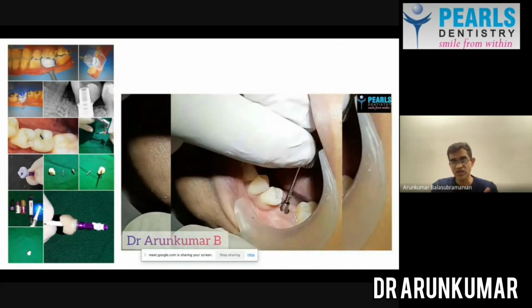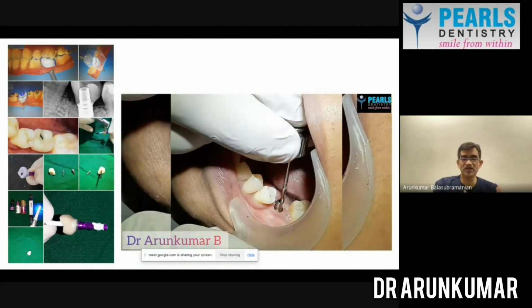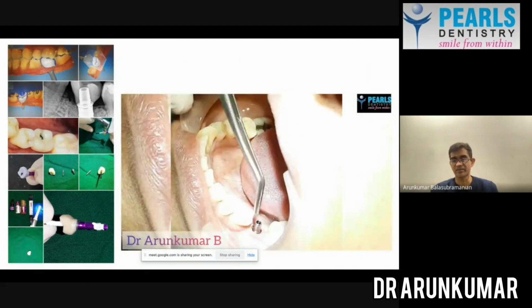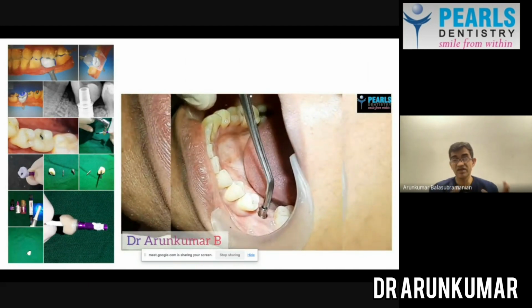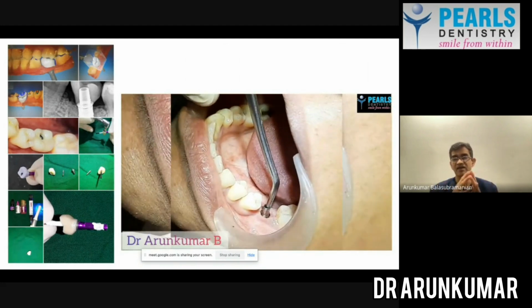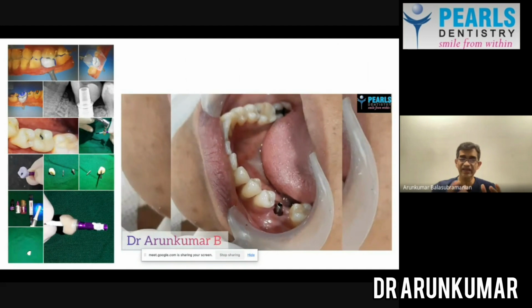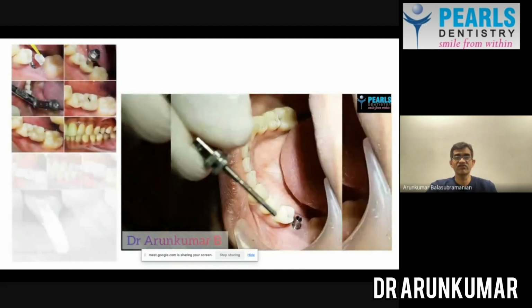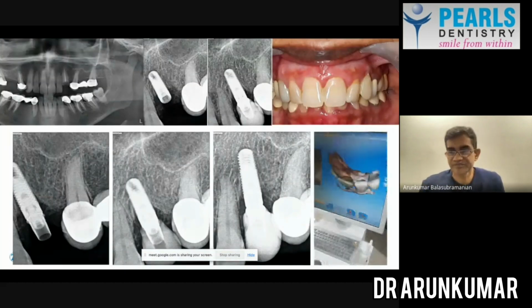So once the crown is out, we can then fuse the crown to the abutment. What you see me take out is called an abutment. So this abutment is taken out, the crown is fixed onto the abutment, and once the crown is fixed onto the abutment, then we can fix the crown back. So it gives a very accurate crown, right?